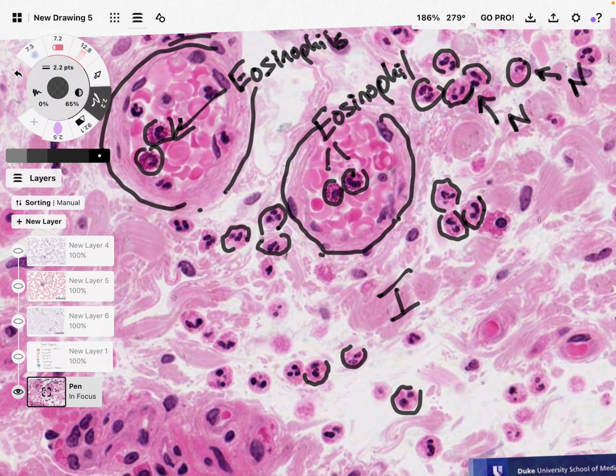Neutrophils have the ability to escape blood and go into the interstitium, and indeed that is an important feature of a neutrophil, particularly under the influence of this cell right here. This cell is a mast cell. Mast cells tend to exist in the interstitium. It often is described as looking like a fried egg, or like a very granular looking fried egg. Kind of looks like that, definitely. The nucleus looks like a nice yolk. You can see it has all these wonderful little eosin stained vesicles.